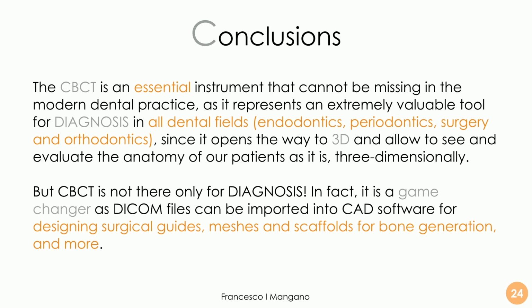So the point is diagnosis, of course, that is the basis for everything, the basis for treatment planning, but also the impact of cone-beam computed tomography as a game changer, because we can also use the images from cone-beam computed tomography to design a series of tools, a series of devices that are very helpful in our practice.